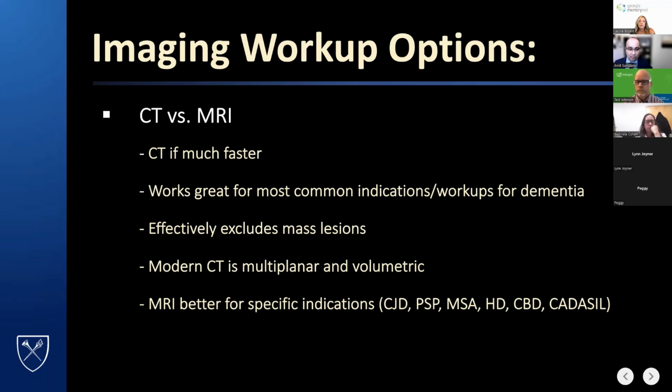So I think you're sort of better off with an MRI, but if it's hard for a patient to cooperate or tolerate a long examination, if cost is a consideration, if you just want sort of easier access to something, MRIs tend to have a little less availability. CT is still a really good test for looking at most of the things that I've shown that are frankly the common diagnoses.